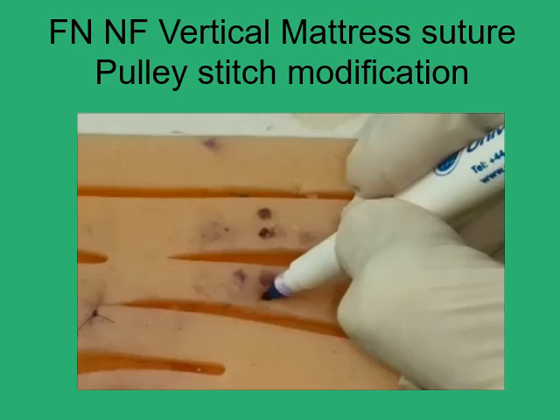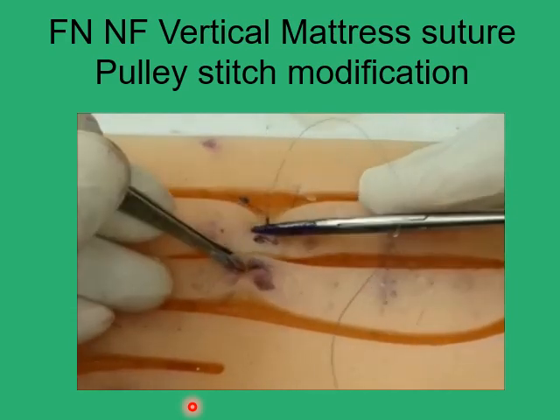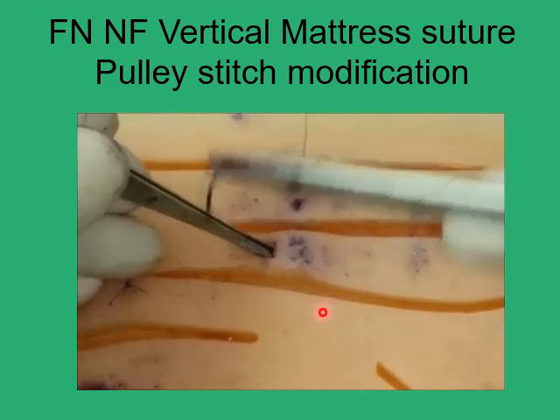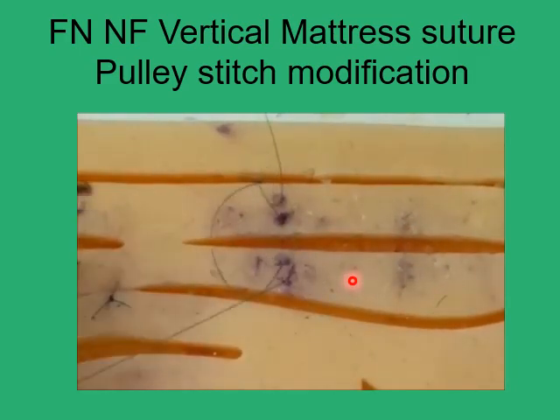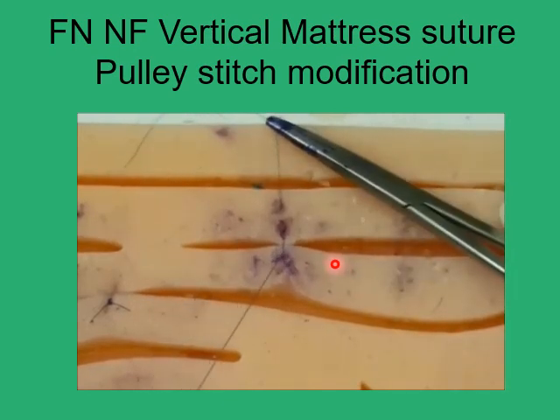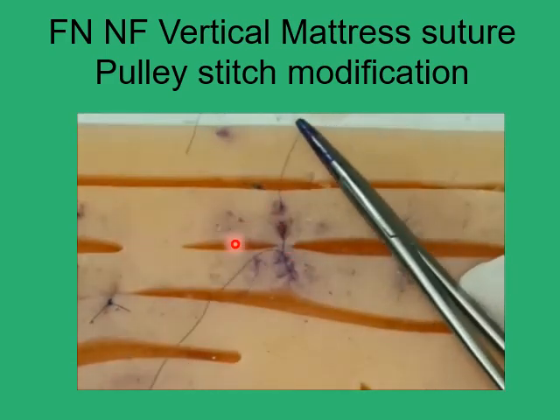Another modification to the far-near/near-far suture is the pulley stitch modification. You perform the usual far-to-near and near-to-far suture, then pass the needle through the loop and retrieve it. This produces the pulley stitch, which holds the wound edges much better — as you can see, without any tension or locking on the suture ends, the wound edges are fairly well apposed with this pulley stitch modification.